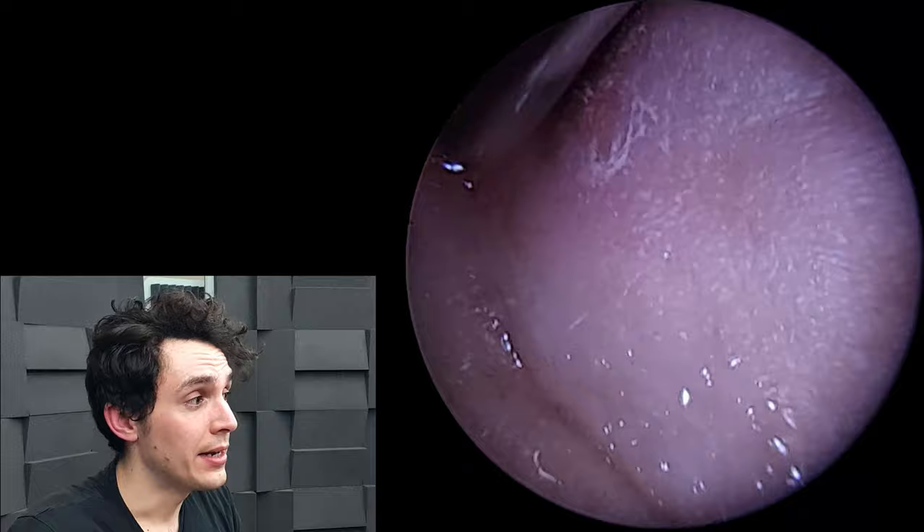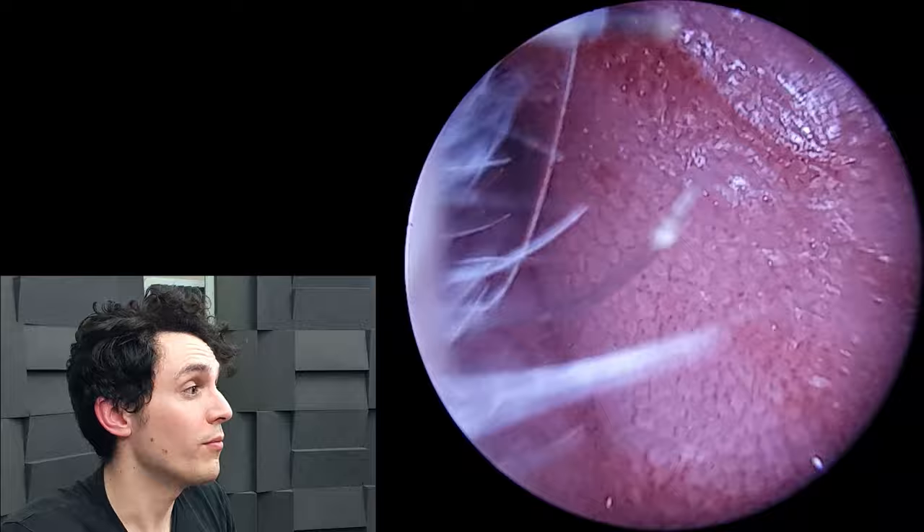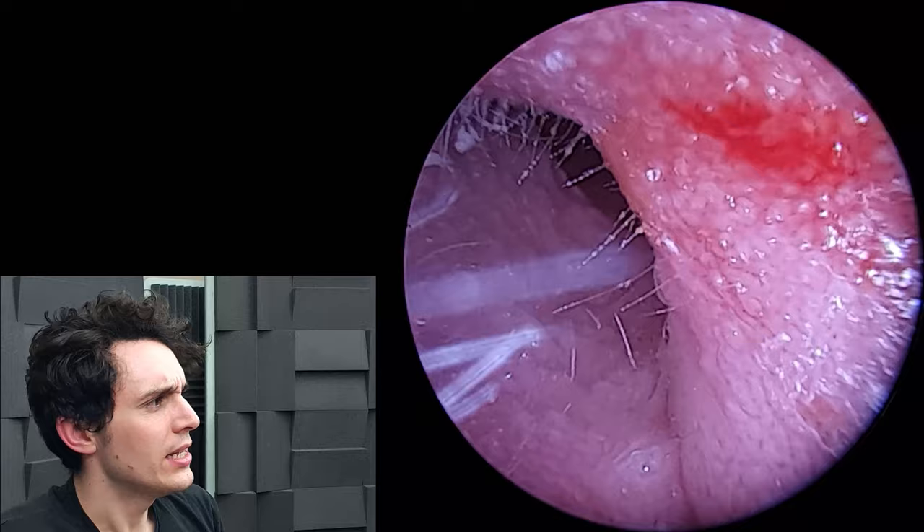The doctor prescribed Otomize, which is a common treatment in the UK for otitis externa. You can see that bleeding just there — the external ear looks very sore at the point where I need to lift up the cartilage to gain access.